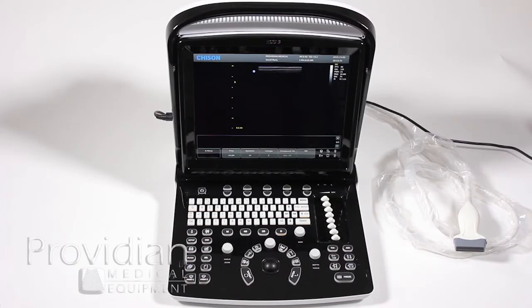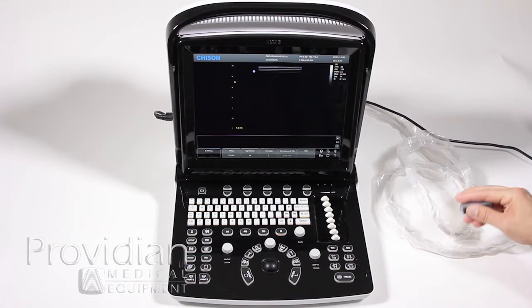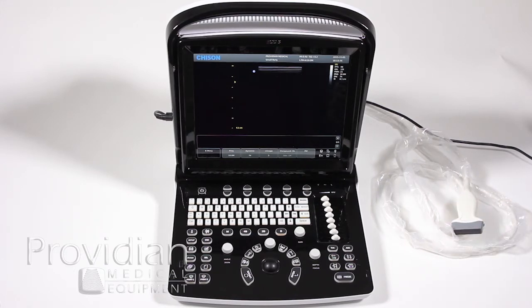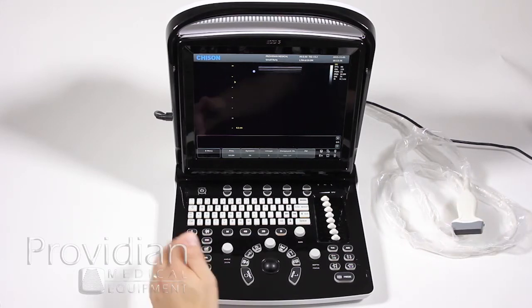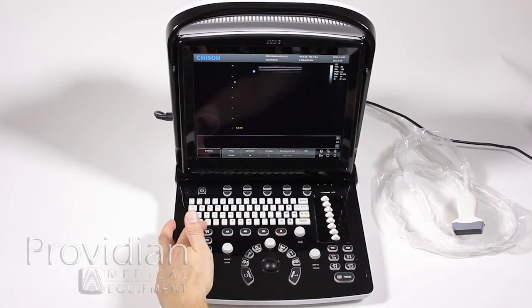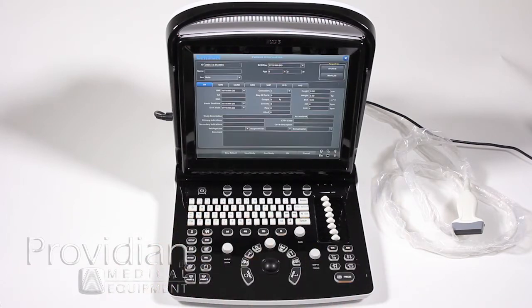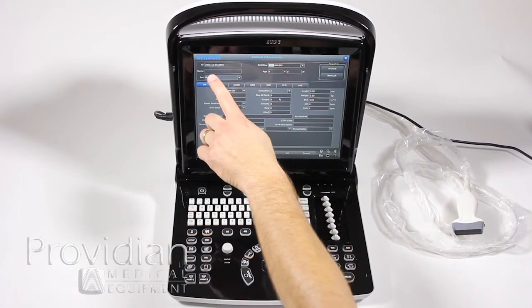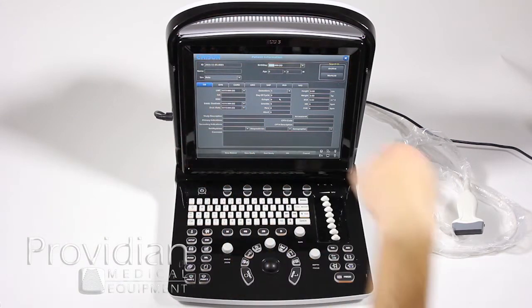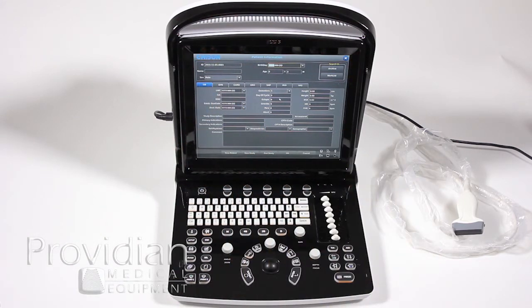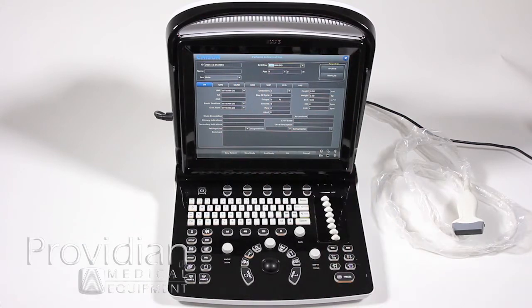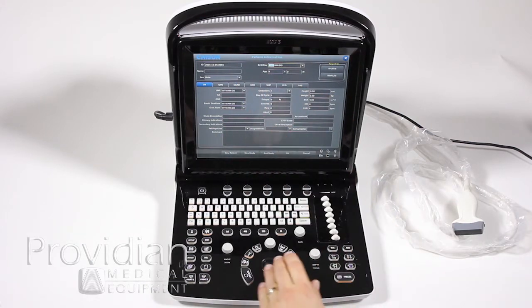When you're ready to begin imaging, you turn it on, it has a live image and you're ready to go. The first thing you need to do is enter your patient information. Start up here with the patient information key. It enters an automatic patient ID that refers to the date and which patient it is of the day, assigning a unique patient ID to that patient.